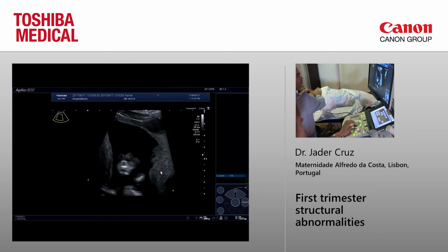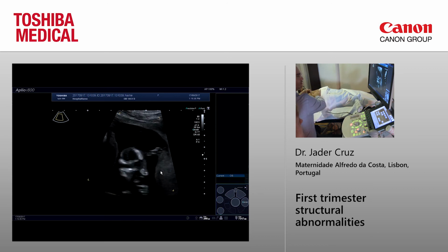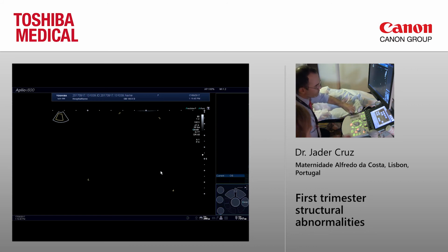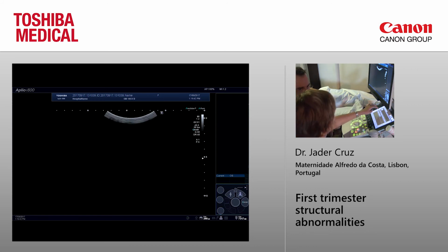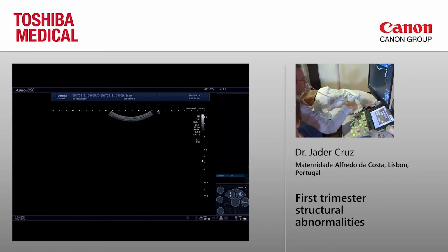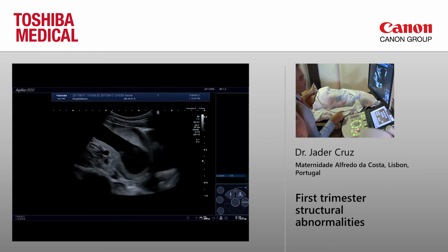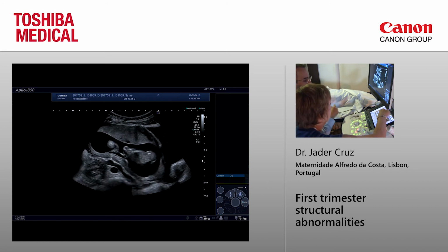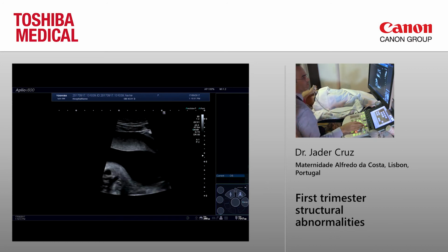Yeah, I wanted to show you that. So now it's really nothing there. Let me try to go back to the heart. Do you have like more 2 minutes? How many minutes do we still have? We have 2 minutes. Oh, wait. Heart? Heart.